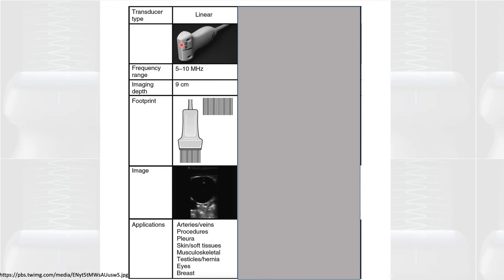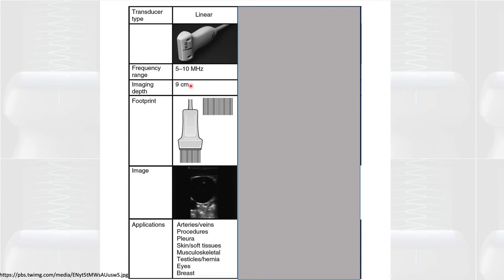Now let's talk about the types of probes used mostly in internal medicine. There are mainly three. The first is the linear probe, named for its shape. It's also called a high-frequency probe because it operates at higher frequencies than the other probes. From physics, a higher frequency means the beams cannot penetrate great depth — maximum around eight to nine centimeters — so it's sometimes called the shallow probe. The image appears in a rectangular shape.